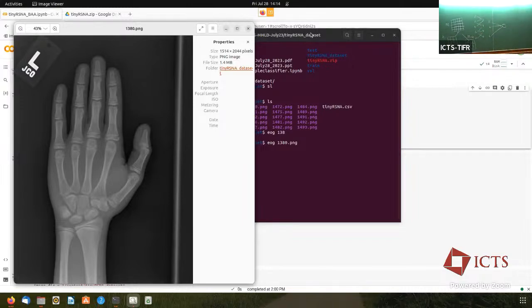I don't want to get into the math of how this works, except to say that essentially what a convolutional network does is apply compositions of convolutions. You have a convolution, then another convolution, then another. So these are compositions of convolutions, with certain renormalizations going on. Maybe later I'll show you a view of what VGG16 looks like. Because there are many layers, that's why it's called a deep network. That's all there is to know.